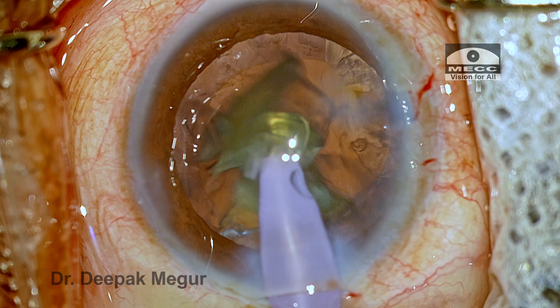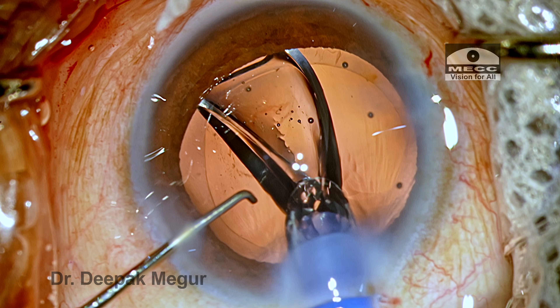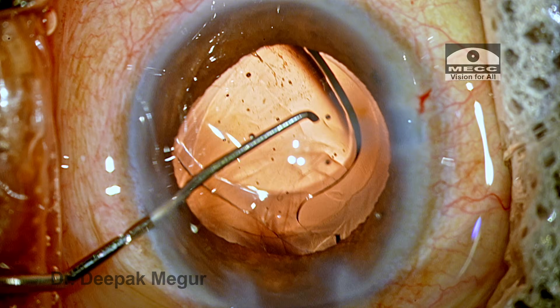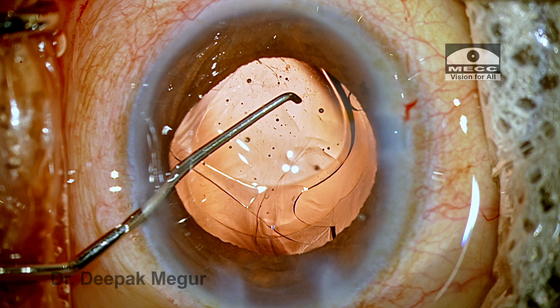Hi, this is Dr. Deepak Meghur. When you're doing a perfect phacoemulsification and you're just thinking to implant the lens and get over with the case, and when something like this happens, it's really heartbreaking. This is yet another case where the haptic has been amputated, and let's try to understand how to manage this.